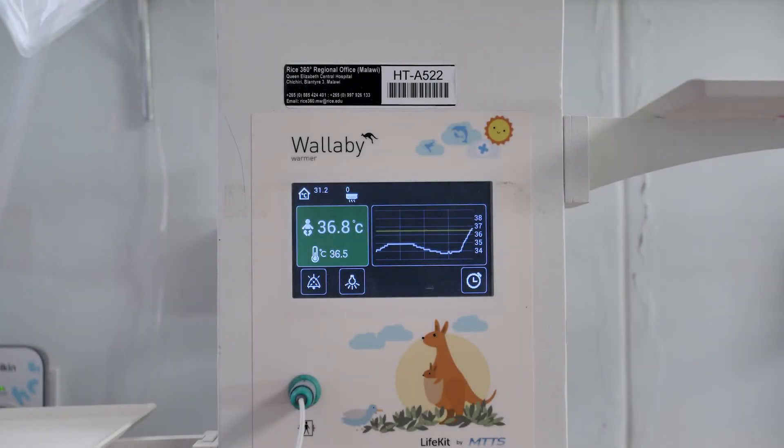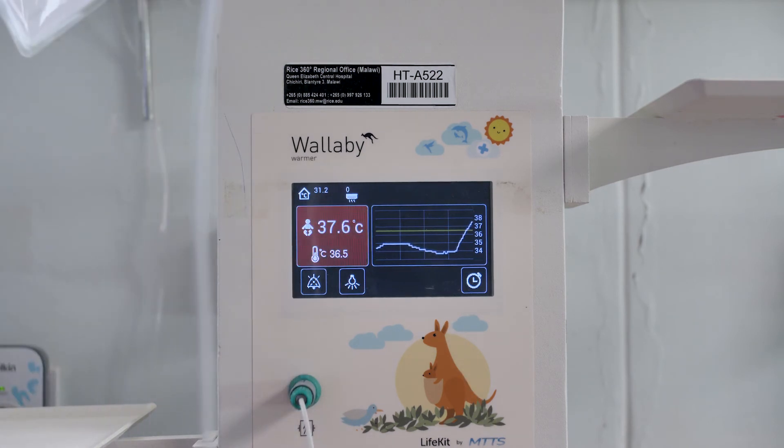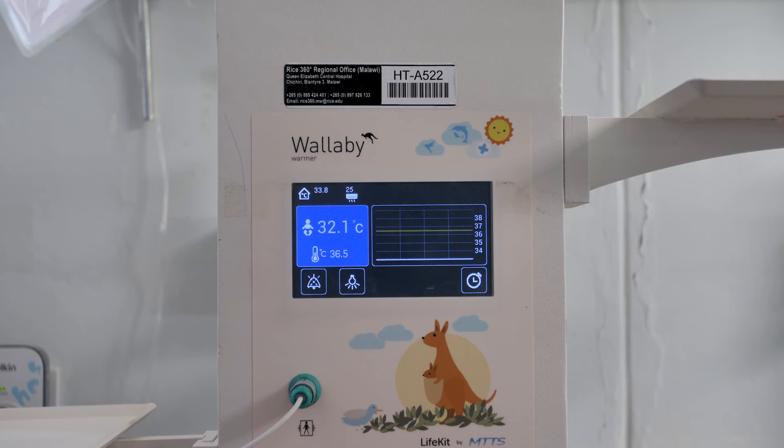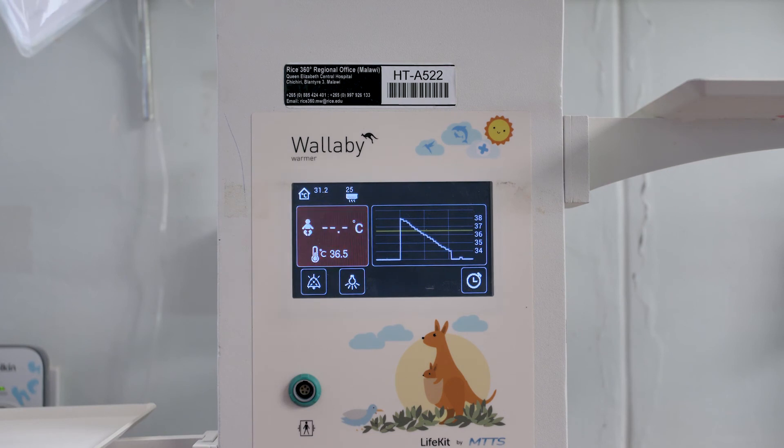On the Wallaby warmer, the temperature alarms are color coded. Green tells you that the baby is close to the target temperature. But as soon as the temperature goes above the safe range, the alarm will sound and the reading will flash red. If the baby gets too cold, the alarm will flash blue. If the probe gets disconnected, the alarm will go off and the temperature reading will disappear.